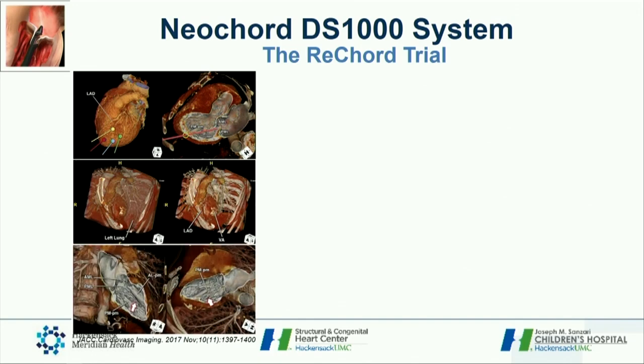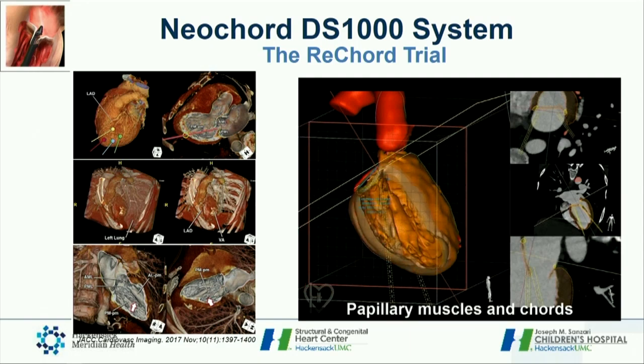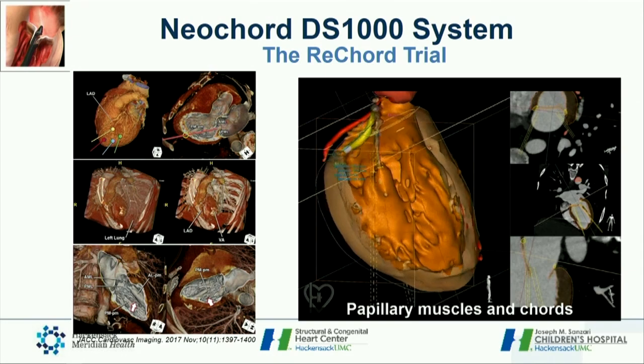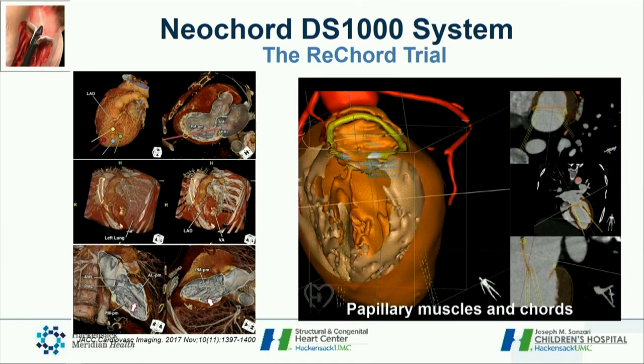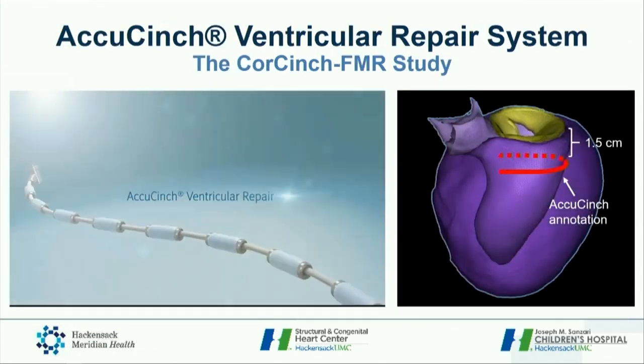Additionally, there are also the anterolateral papillary muscles as well as the posteromedial, where one has to take extra precaution. So here, in this modeling, you can create the whole segmentation of the heart, and you can also create the segmentation of the papillary muscles, and then create a trajectory from the skin into the muscles that you can use to perform the punctures.